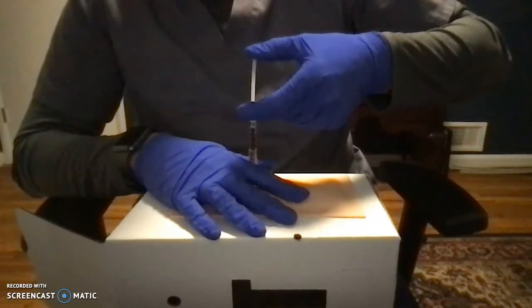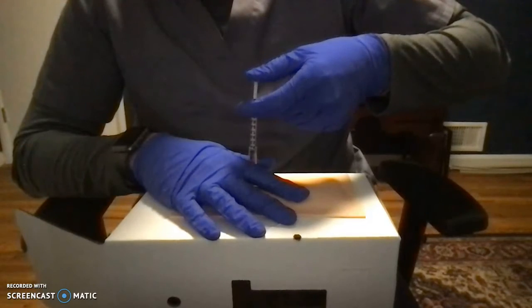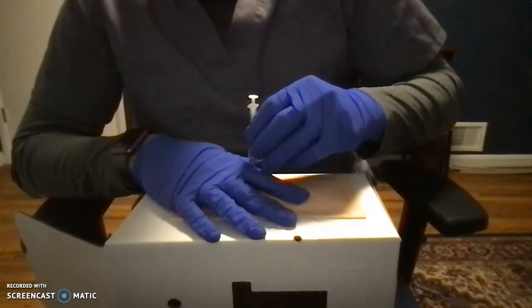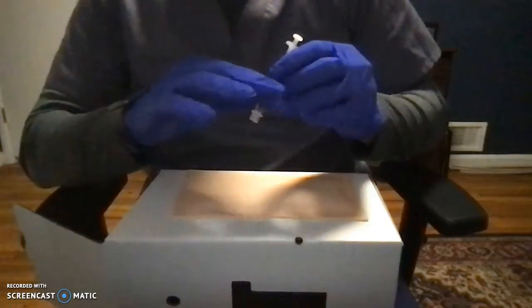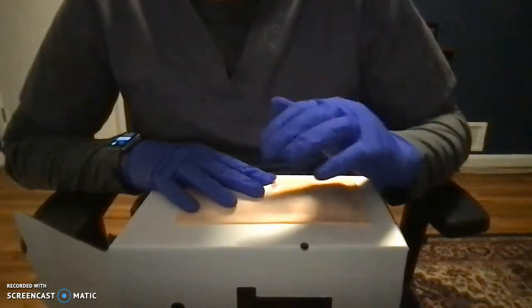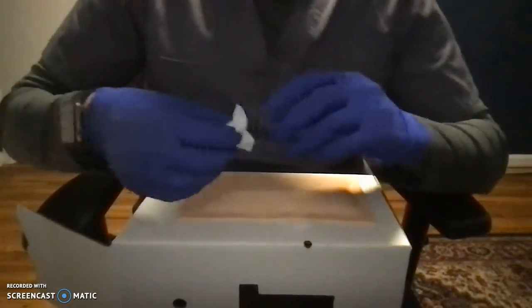slowly. The reason we're doing it slowly is because we want to make sure that everything gets administered in there and it's nice and gone. And basically it should take about 10 seconds for everything to go out. Once this is done, we're going to go ahead and remove it, put the cap on. We're going to hit it with a gauze right here. We're not going to massage or anything. We're just going to place the gauze or the alcohol swab just gently over it. And then we would put a Band-Aid or something over the site to make sure that it was okay.